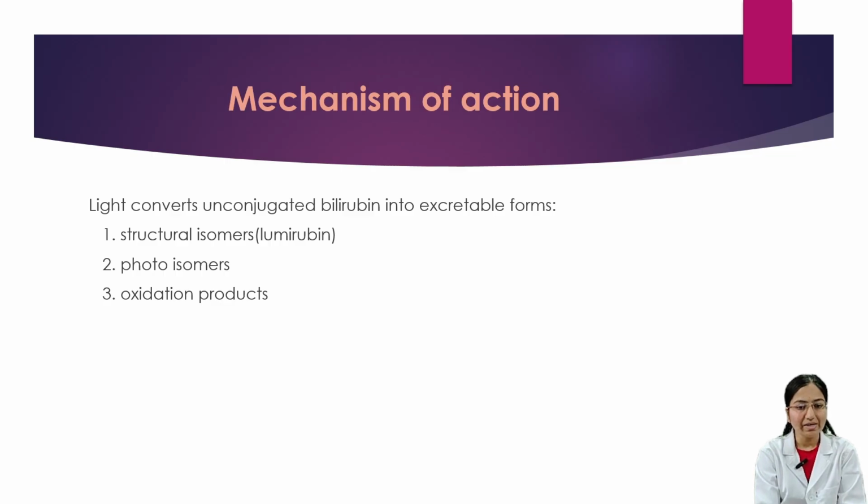Next we'll see the mechanism of action of phototherapy. Here light converts unconjugated bilirubin into excretable forms, that is structural isomers, photoisomers and oxidation products.